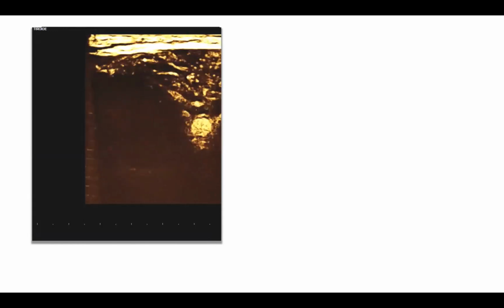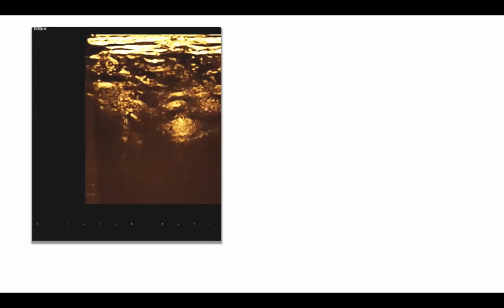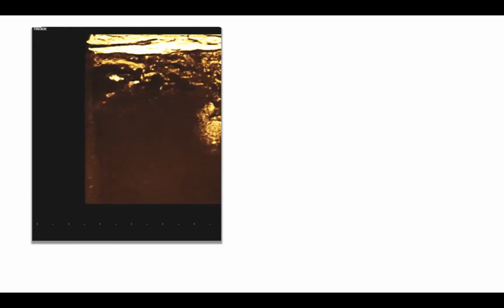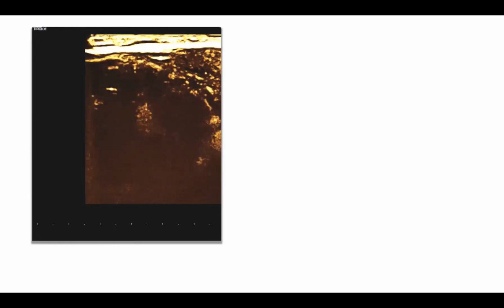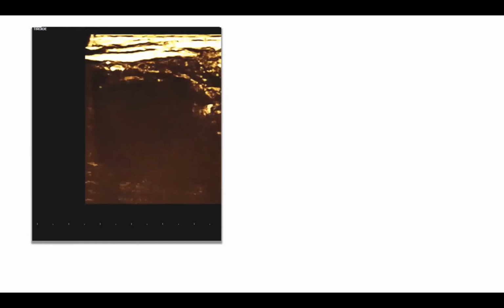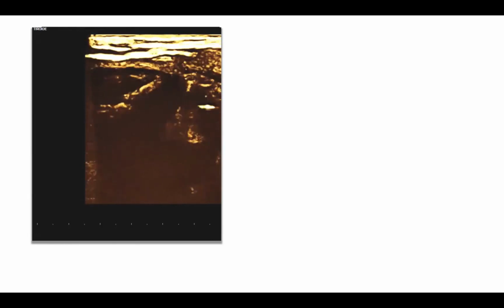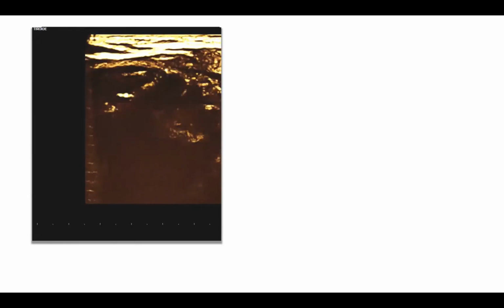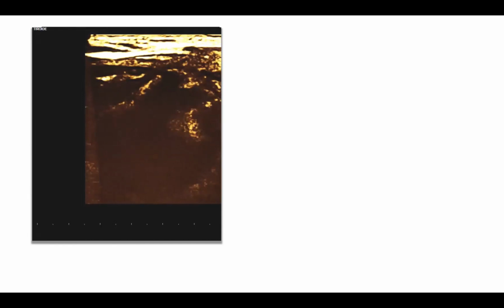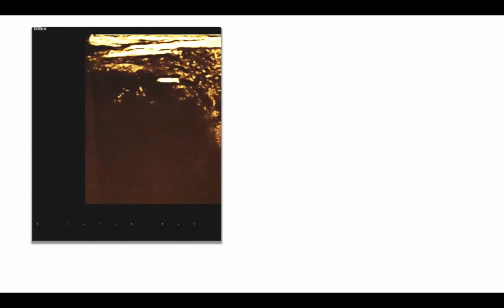At the end, immediately at the end of the procedure, we re-inject sulfur hexafluoride, our ultrasound contrast agent, to visualize if there are still viable areas inside the lesion or the lesion is entirely covered. As you can see here, there is no residual viable solid tumor in the entire mass. So we considered the procedure finished at that point.